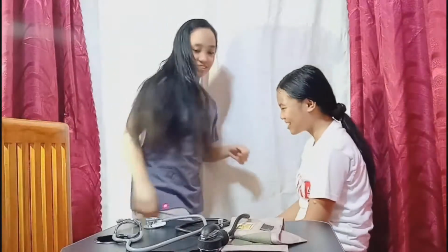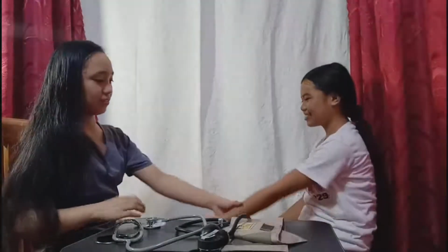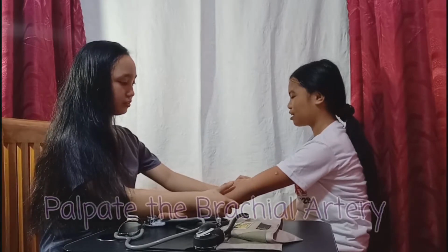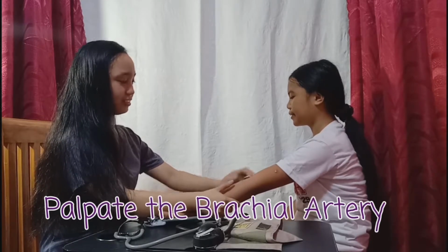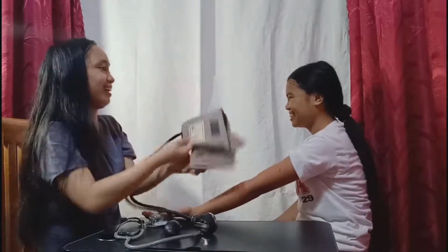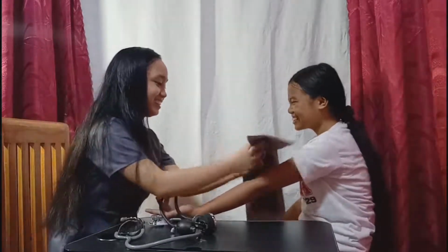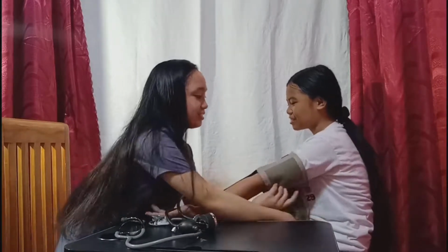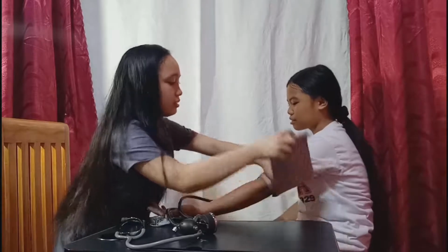Before starting, make sure that the patient is sitting with legs not crossing and arm at heart level. The first step in determining the blood pressure is to locate or palpate the brachial artery in the elbow. Once located, take the cuff and place it 1 to 2 inches above the artery. The artery should be between the 2 tubes of the cuff, going to the pump and the gauge.